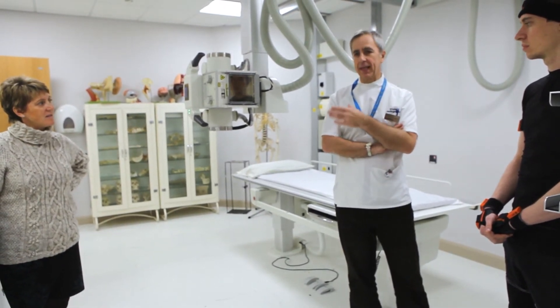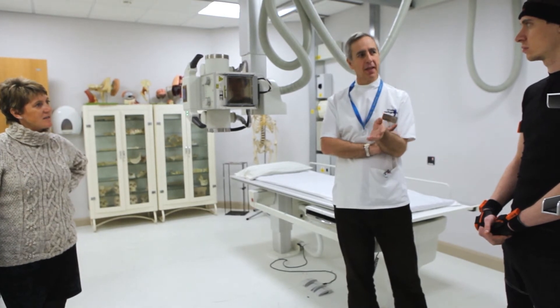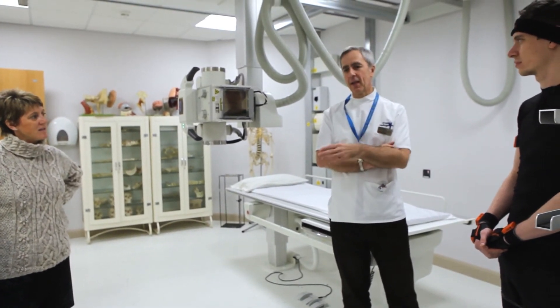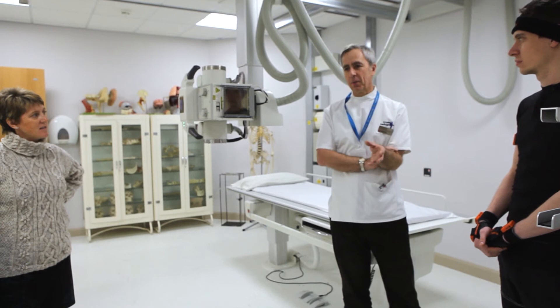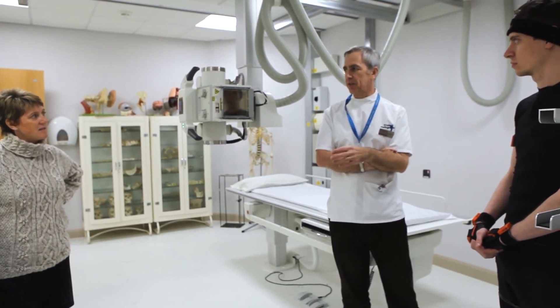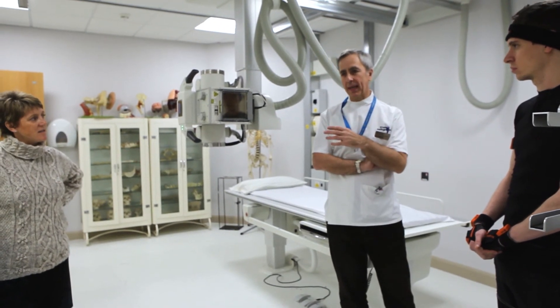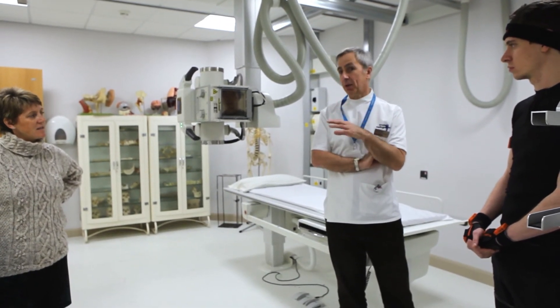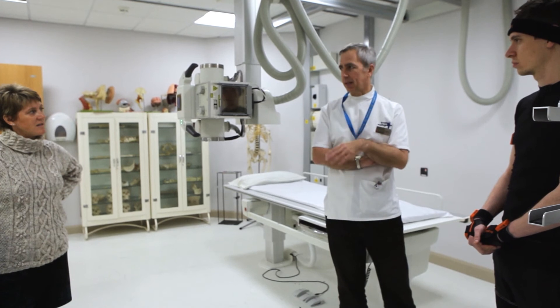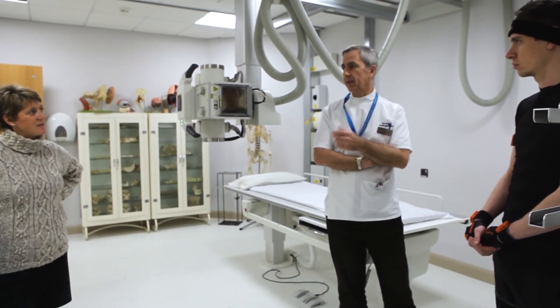We've always said that because of the risk of ionizing radiation, we can't take x-rays of each other. Our physio colleagues can practice on each other, but we've not been able to do that. But actually this does allow us to do that to some degree, because we can position patients, we can make an exposure without really making an exposure, and we can see the results of that on the screen.